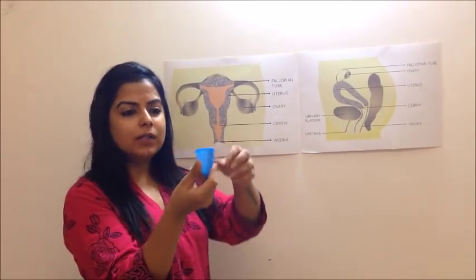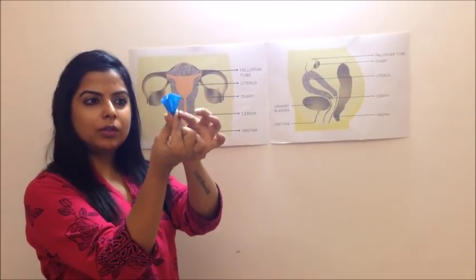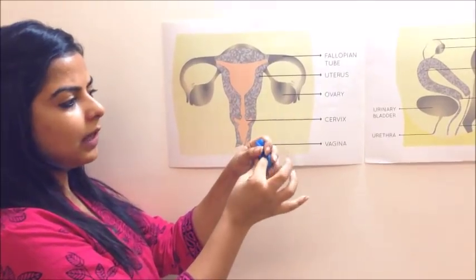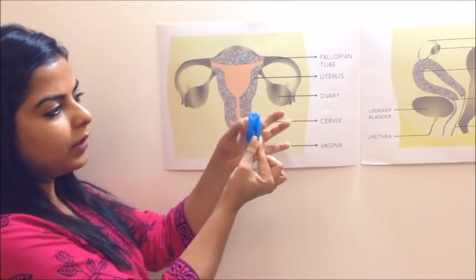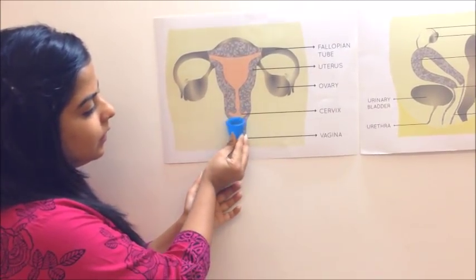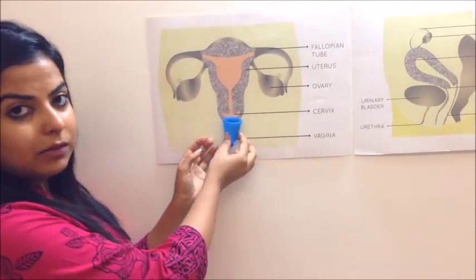Because it's soft, you can easily fold it and it becomes a lot smaller when inserted, then it opens up. To wear a menstrual cup you need to fold it like this, or you can fold it like that, and you can figure out your own ways to fold it as well. Once you fold it, the entrance becomes a little smaller. You fold it, you insert it, and then it will open up inside and form a seal with the vaginal wall and collect your menstrual blood.